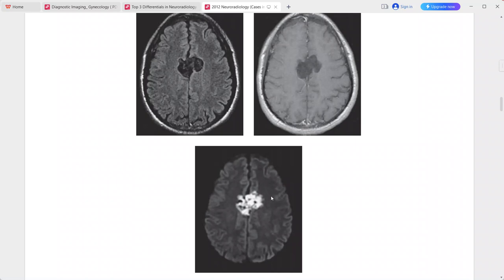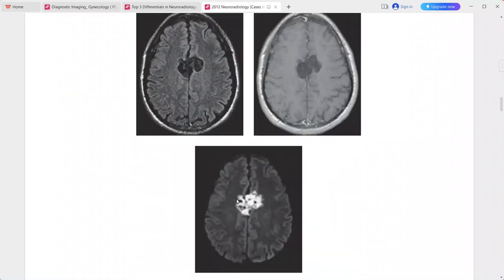However, the lesion is hyperintense on DWI with mild heterogeneous signal on FLAIR. These imaging characteristics are typical for epidermoid cyst. Differentials include arachnoid cyst, abscess, and dermoid cyst.